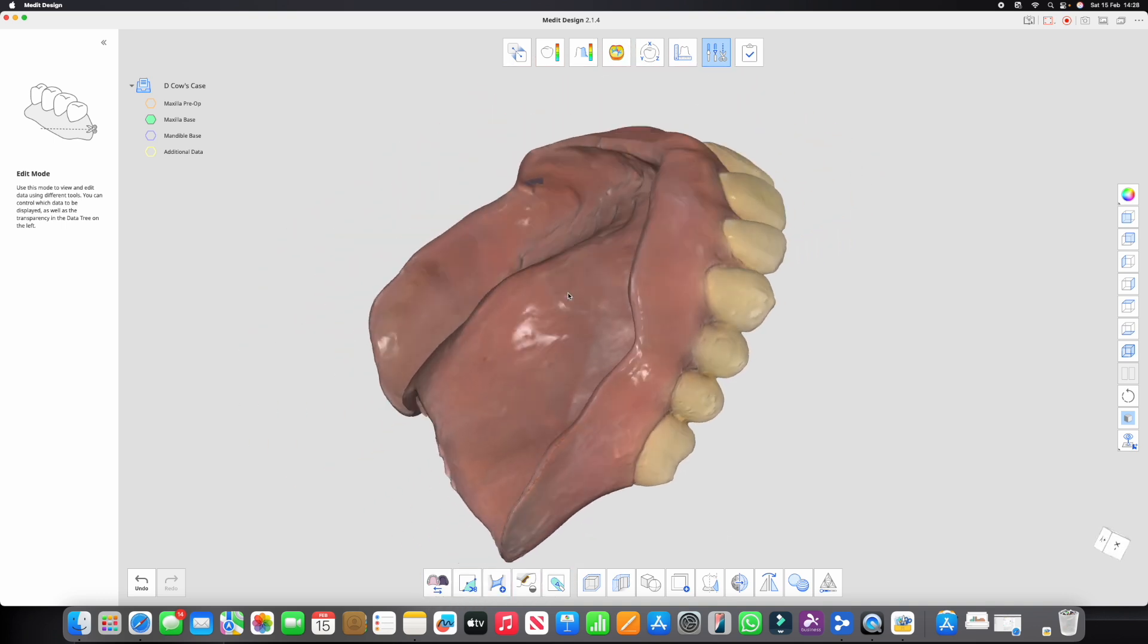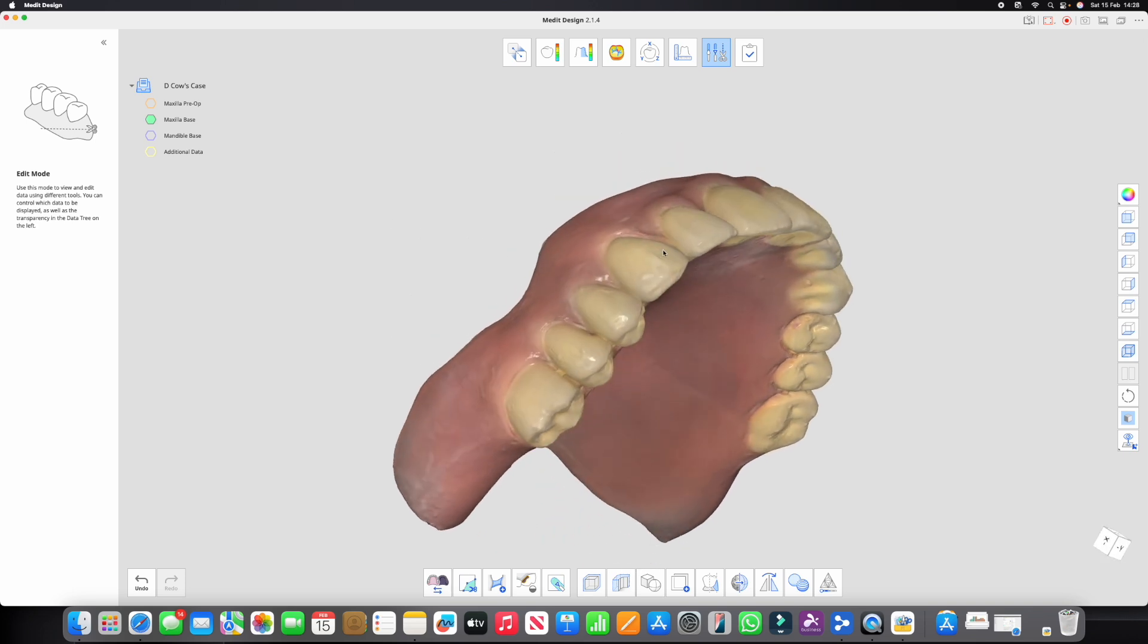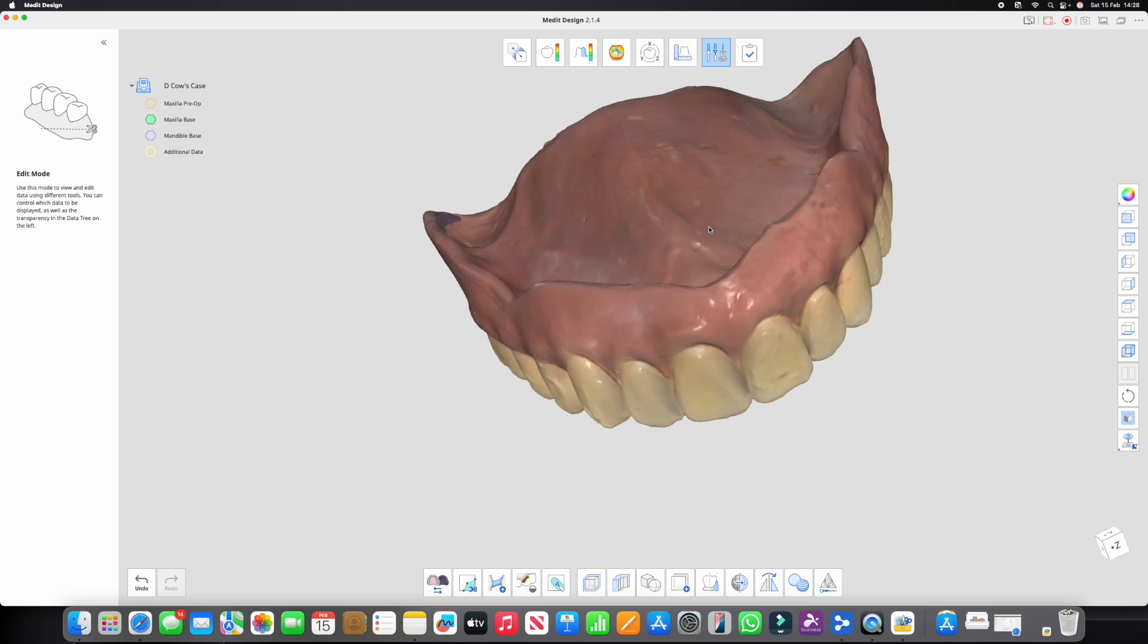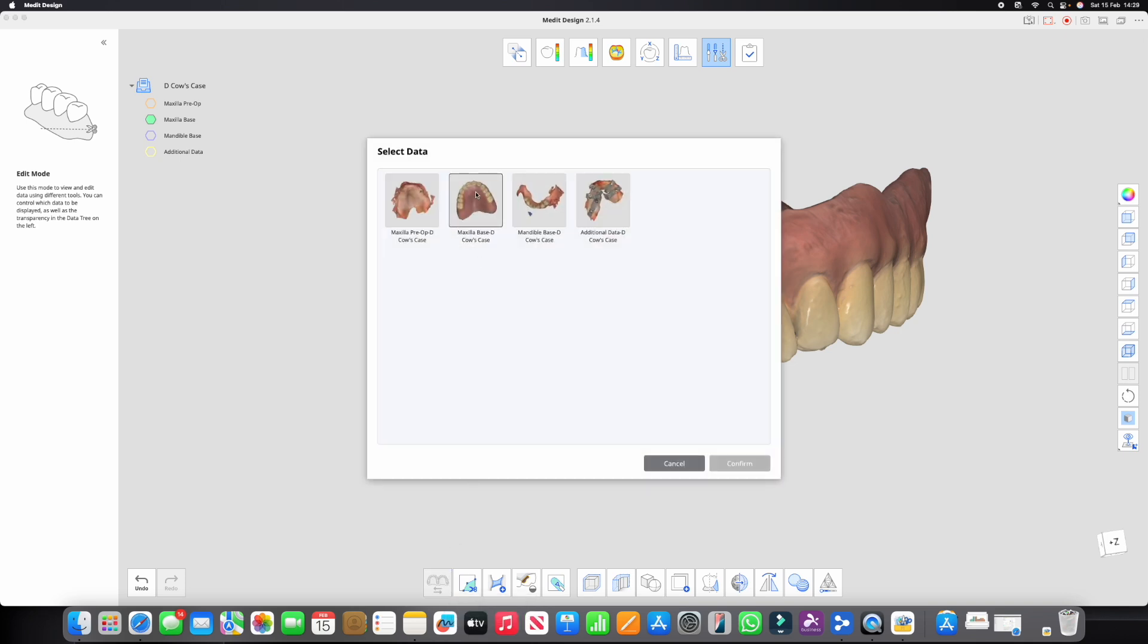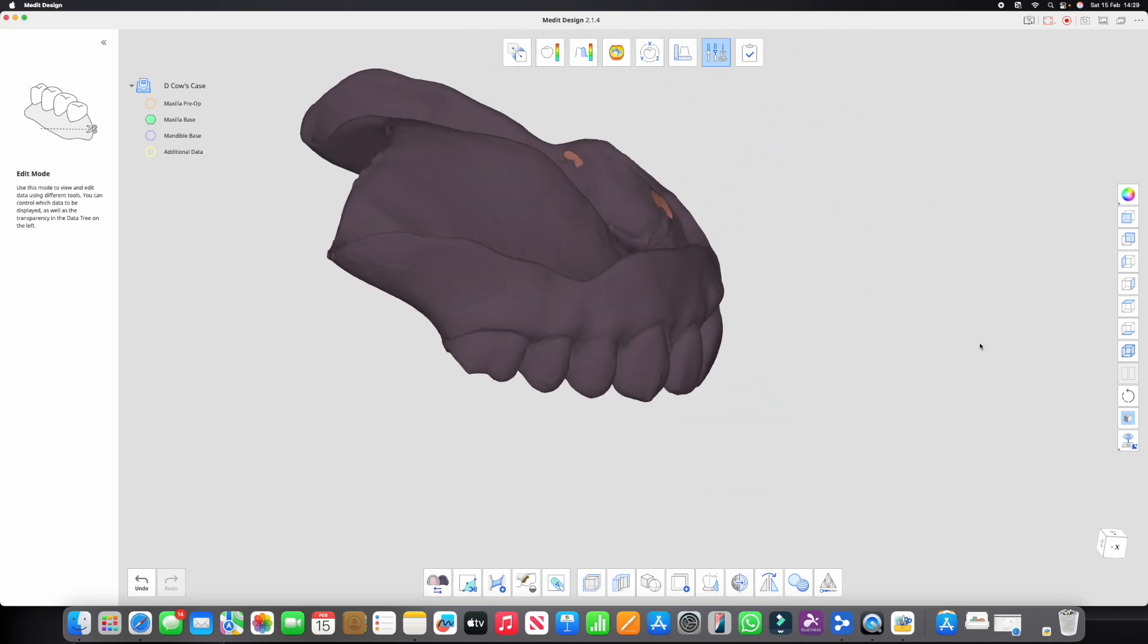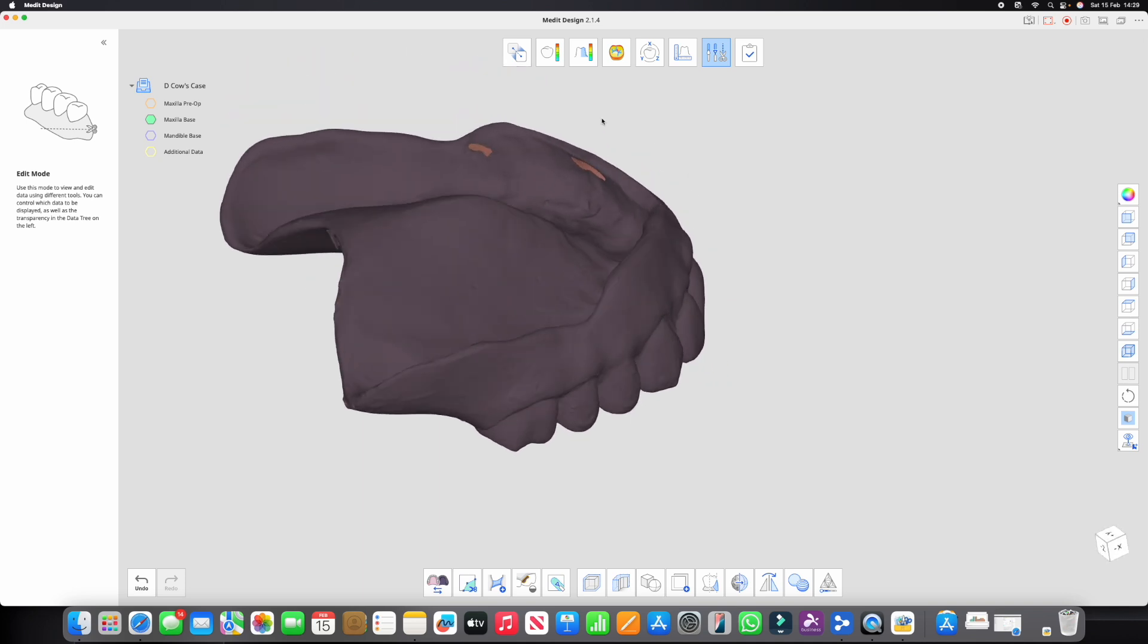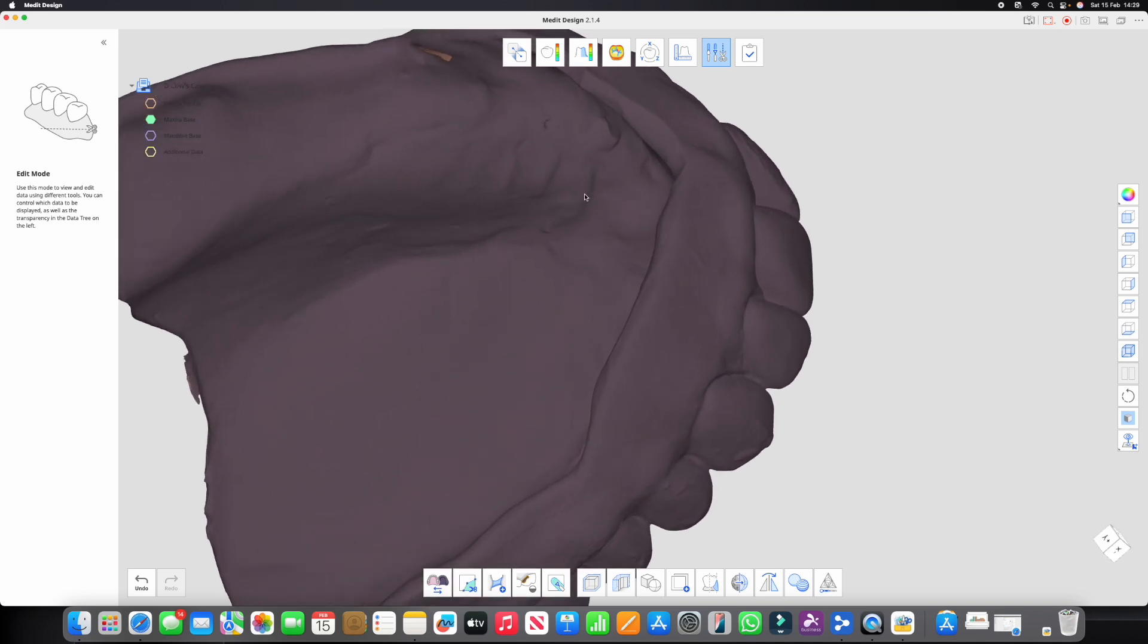So it's very very simple what we're going to do with this. To get it to align with this, we just need to switch the data over. So the denture that we've scanned in its entirety, we're just going to click reverse data, tell it we're going to switch that over, click confirm. Bang, that's now, the surface of this is oriented the other way.